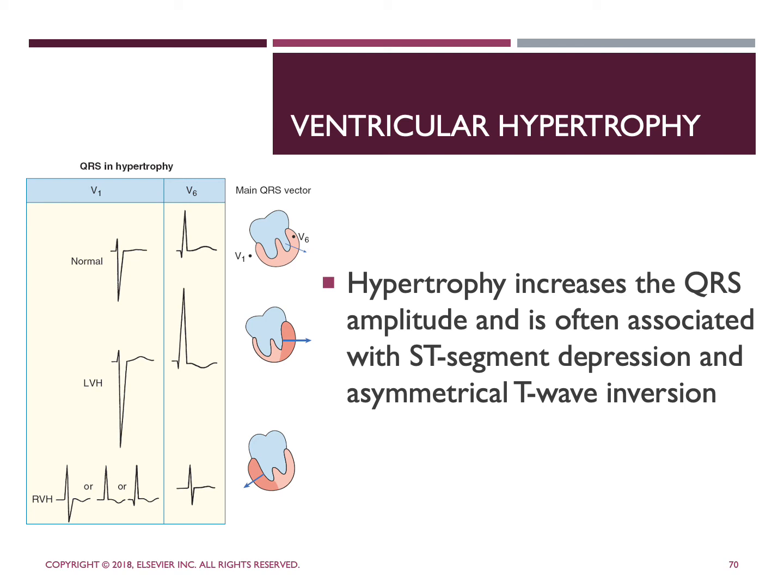Now, right ventricular hypertrophy, or RVH, can shift the QRS vector to the right, usually with an RS or QR complex in lead V1, especially when caused by severe pressure overload. T wave inversion may also be present in the right chest leads.